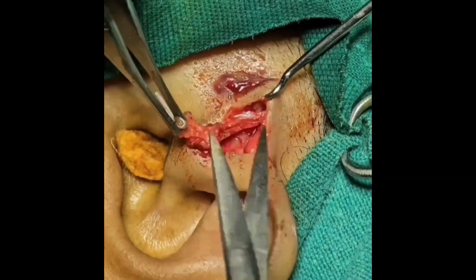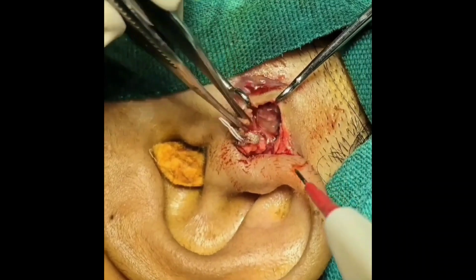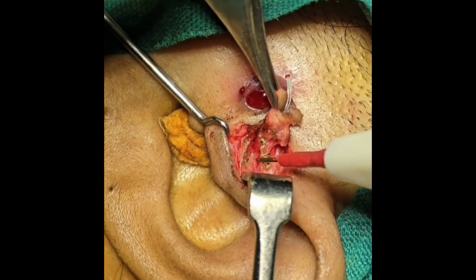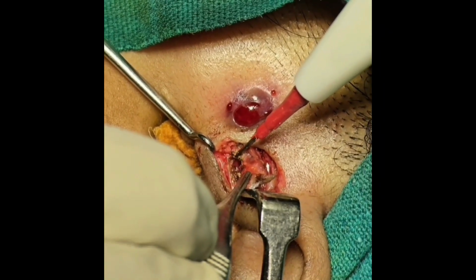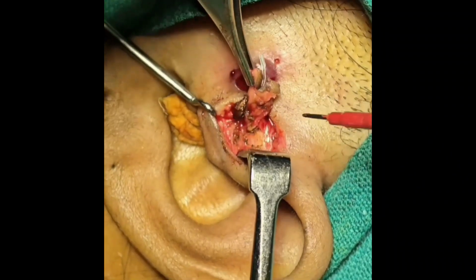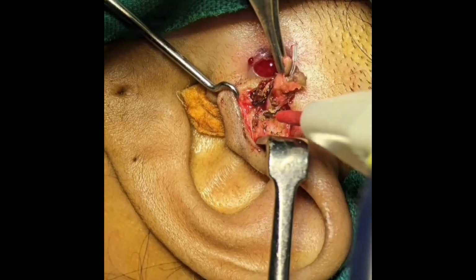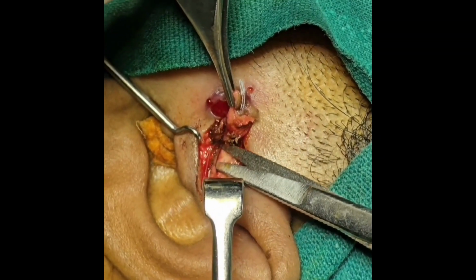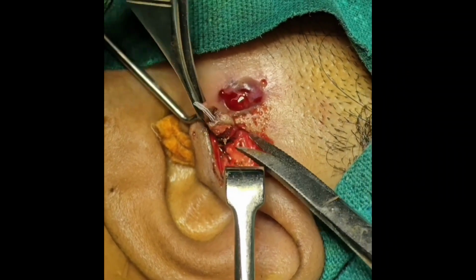So here I am dissecting the tract. I have already cannulated it with the Neoflon, so that will help in identifying the tract, but sometimes there will be multiple tracts, as was in this case. So now you can see that I am trying to dissect the area in front of the helix and also superficially where the tract is attached. So one has to be careful to remove all the soft tissue that is present in the subcutaneous area, because usually these preauricular sinuses will have multiple tracts, not a single tract.